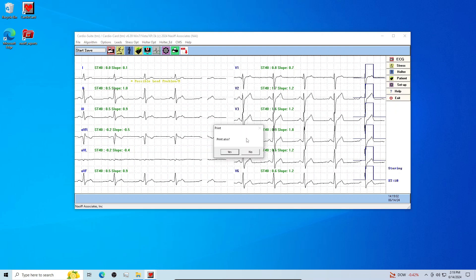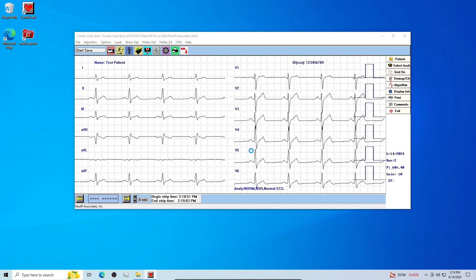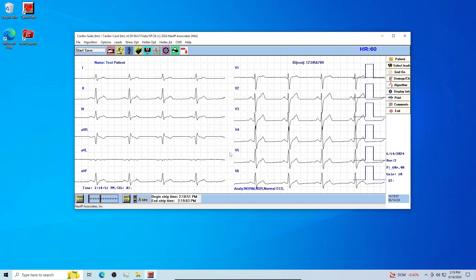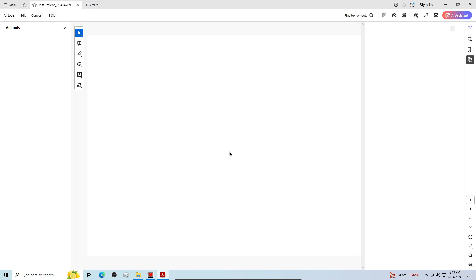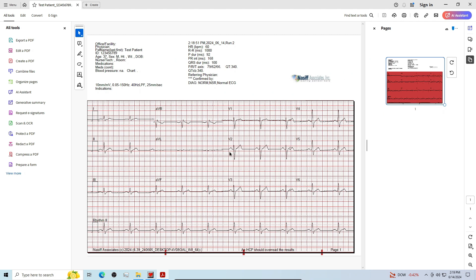Answer yes or no if you would like to print to paper. Answer yes or no if you would like to print to PDF. As set by default, your digital test report will automatically open after performing the test.